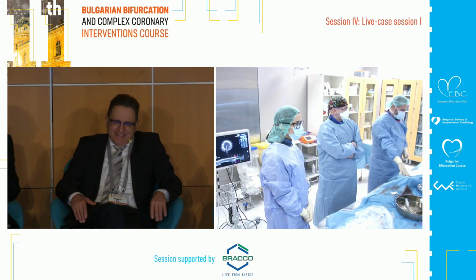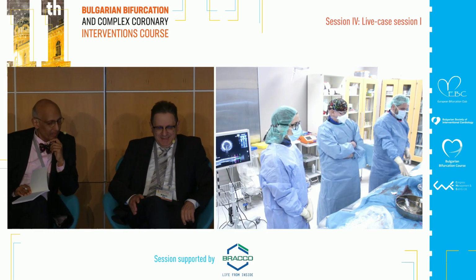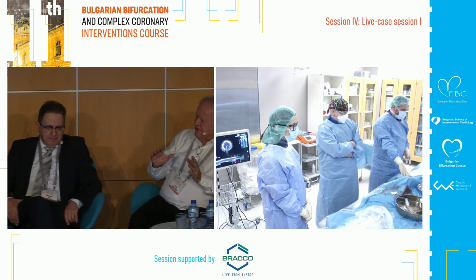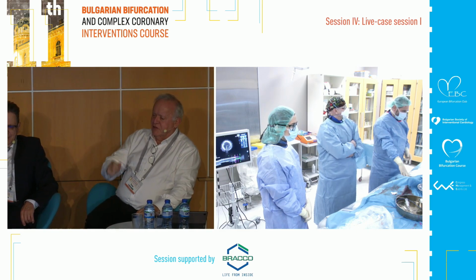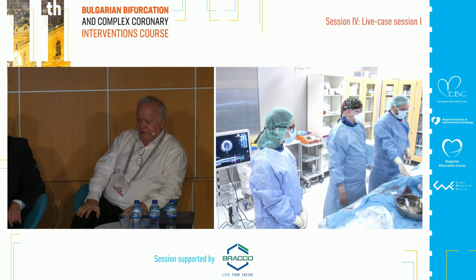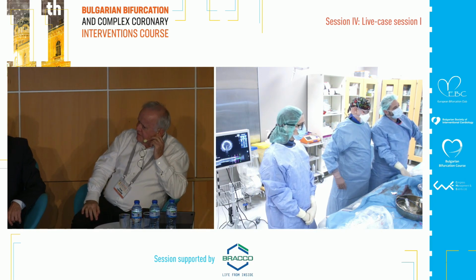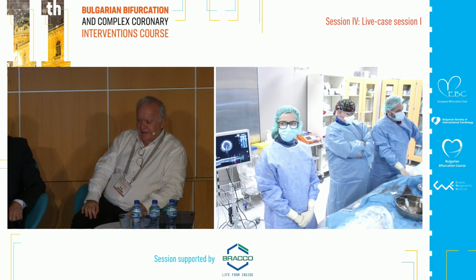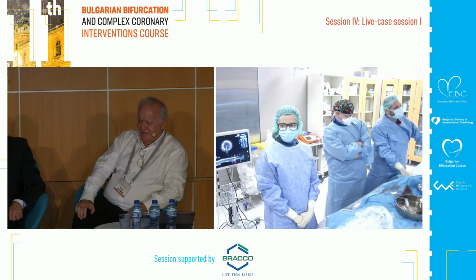Yeah, of course. But the problem then can be also you can stand inside the aorta. You don't want to do that. Having the wire, I think, is a good choice. Okay, what is your simple choice, Gianluca? To put a wire inside the aorta is not my preferred technique for ostial lesion, but if you want, we can put it.